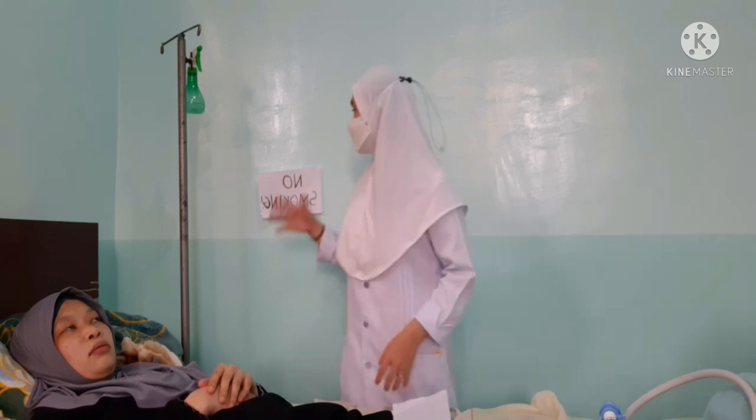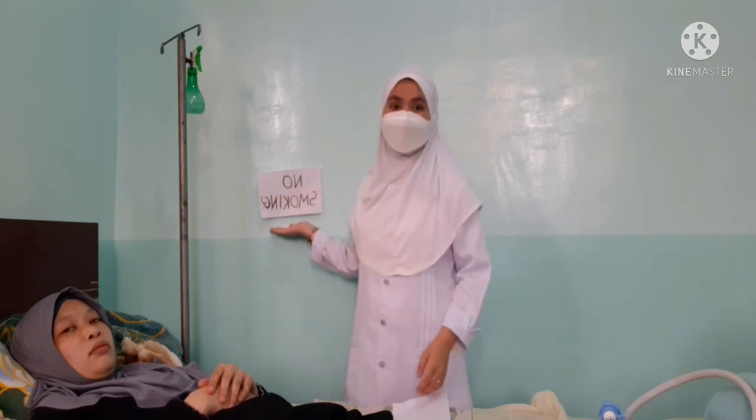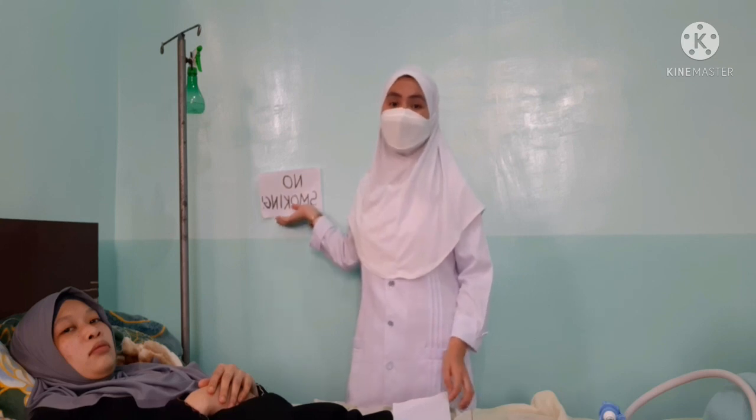First, check the doctor's orders. This is to determine the need for oxygen therapy. Prepare the necessary equipment to save time and effort. Post no smoking signs on the door and in view of visitors to ensure safety. Explain the procedure to the patient to facilitate compliance with the procedure.